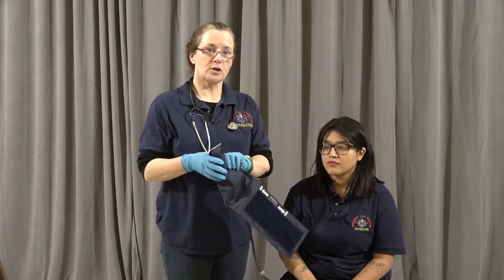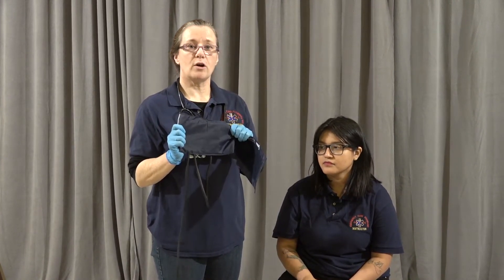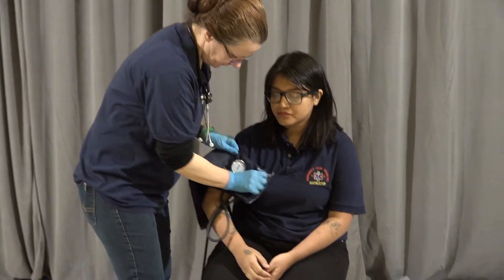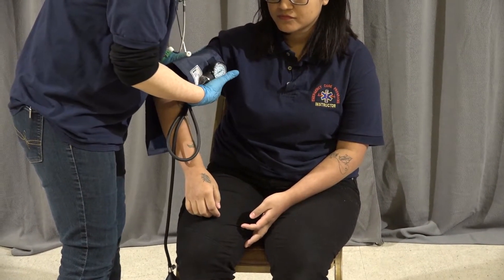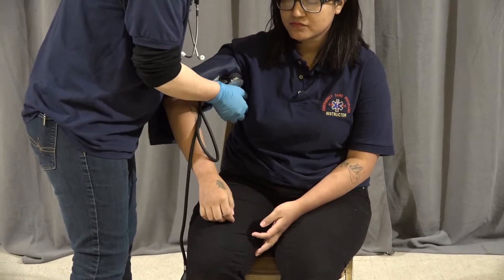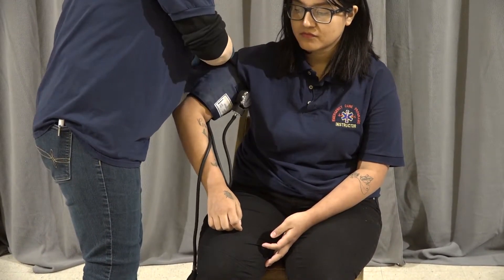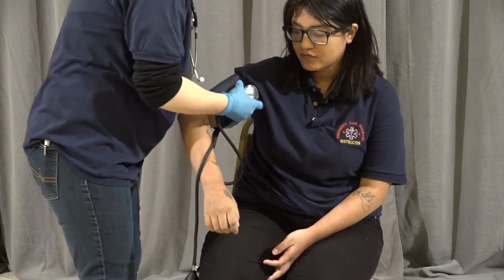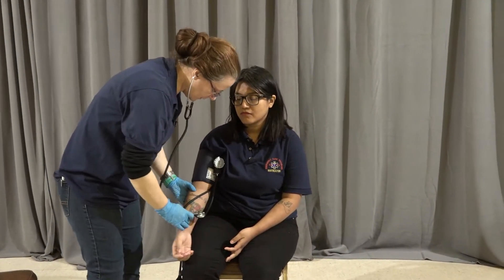I'm going to move on to blood pressure. I'm going to place the bladder of the blood pressure cuff over the brachial artery. The bladder should cover about two-thirds of the arm and should be above the joint. I'm going to place my stethoscope in my ears and place the diaphragm below the elbow on the brachial artery.